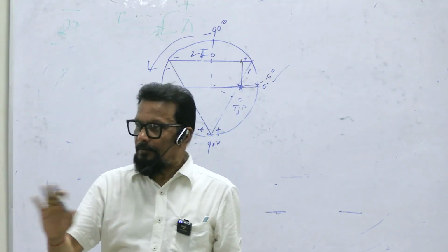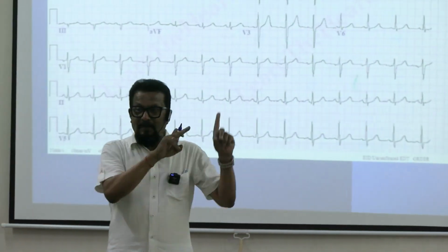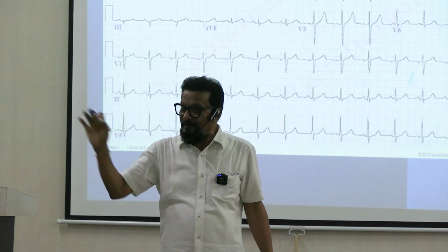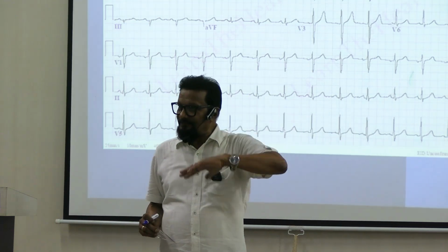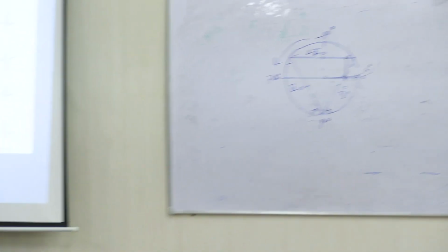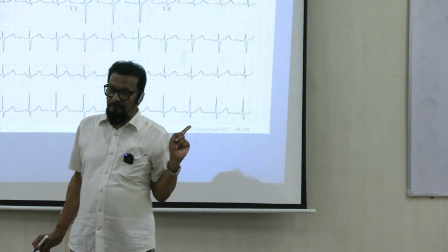Can you understand this? So first what you do, I have to draw a triangle. Then marking is important, which side? Positive, negative, it is important. Then here's the center. Then draw a circle. Make it half, upper half, lower half. Then every side, okay? If anybody is having any doubt? No, okay. So this is the accurate method.